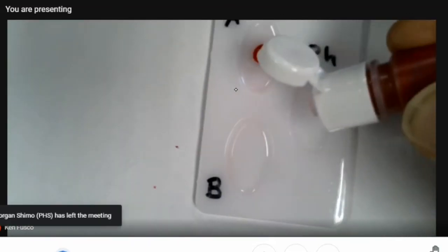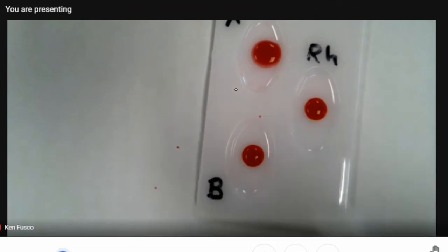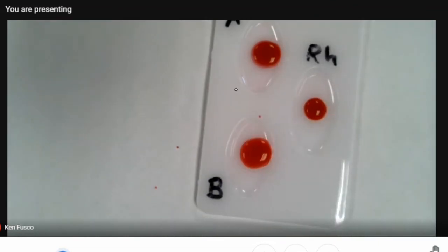Okay. Last patient. We got last patient. Patient 4. Anti-A. Anti-B. Anti-RH.